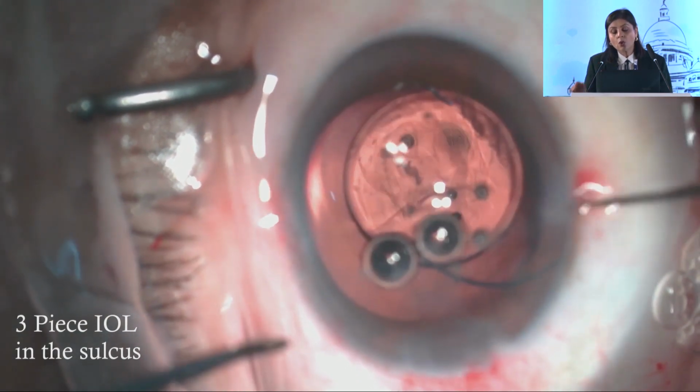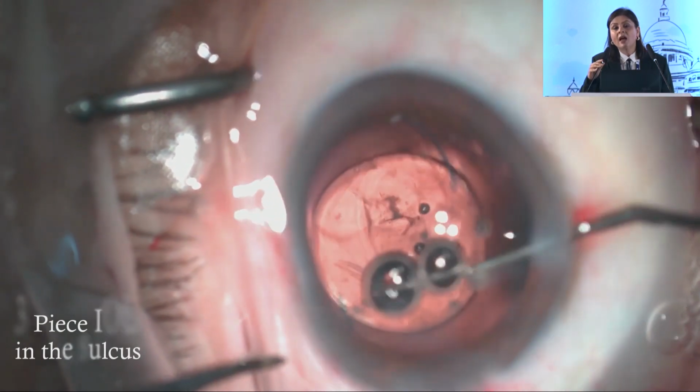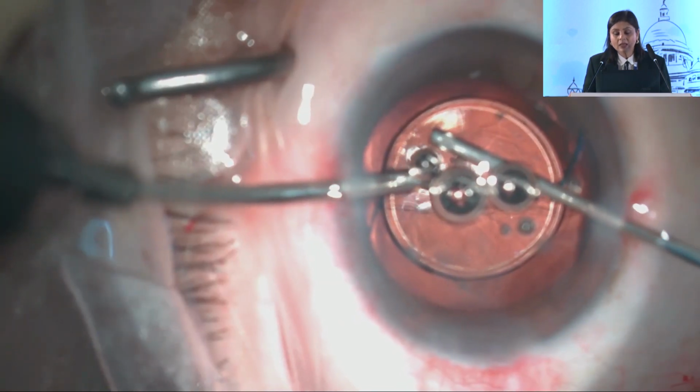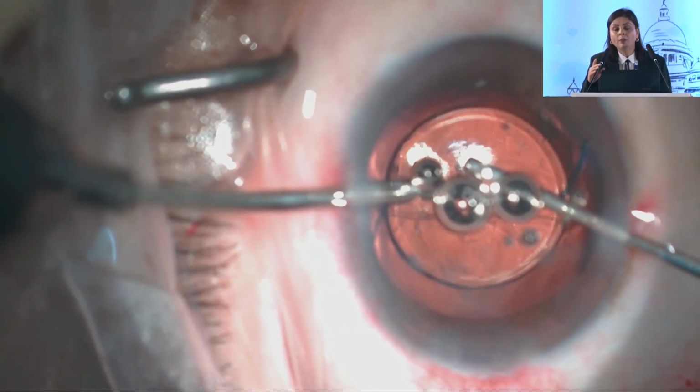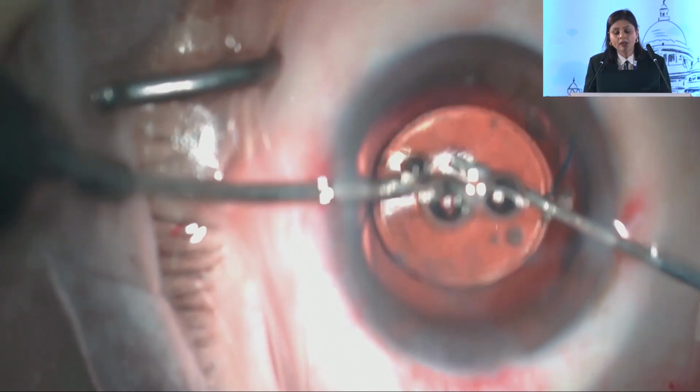So in posterior polar cataracts, we must always keep a 3-piece IOL in our inventory, just in case we need to put an IOL in the sulcus. And we have to keep an IOL of suitable power, as we have to adjust the power of these lenses as well, since we are placing them in the sulcus.